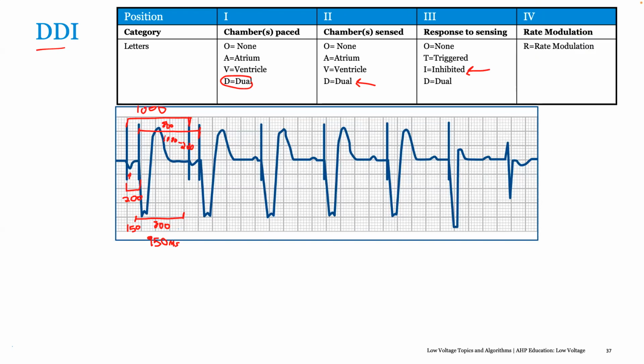And usually this group of people are 80-something years. Permanent AF that has a slow ventricular response from probably a complete heart block or Mobitz type 2 or a high grade AV block. Okay, so what do you recommend in combining? So you're getting ahead of me here.